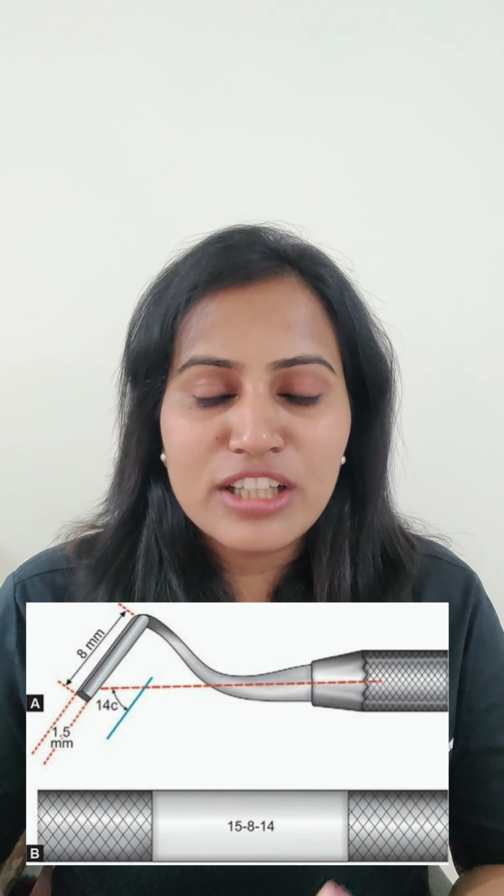In here the first number 15 represents the width of the blade in 1/10 of a millimeter. So 15 means 1.5 millimeter is the width of the blade. Now the second number, that is 8, represents the length of the blade in millimeters. And the third number here is 14 centigrade. So that is the angle formed by the blade with the long axis of the handle. So this is your 3 number formula.